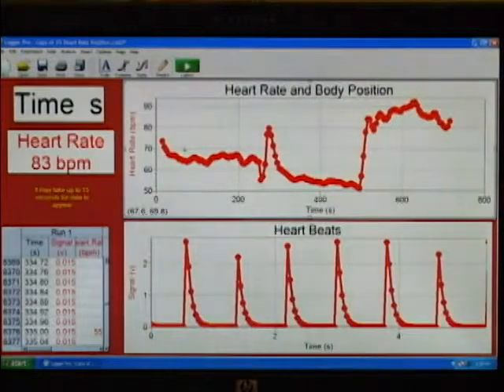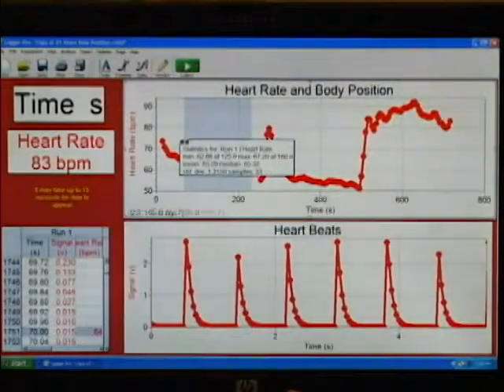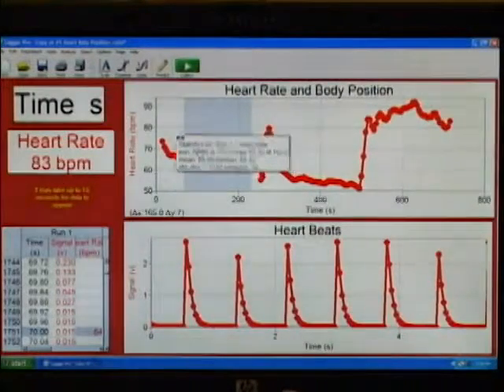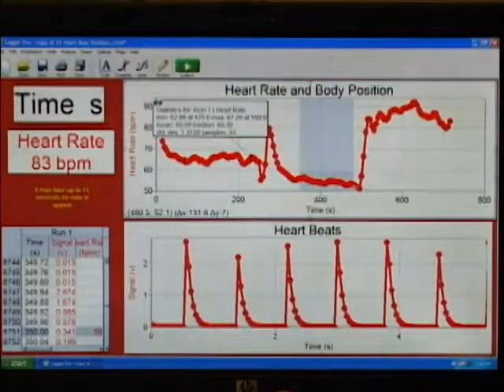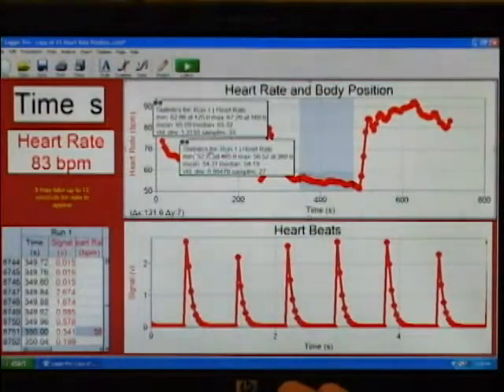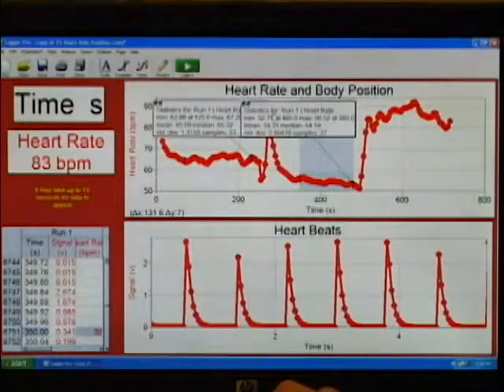Let's quickly take some average heart rate numbers to see what each of those was. If I select a region where he was sitting the entire time and do statistics, I find a mean of about 65 beats per minute for the sitting portion. I'll come down to the lying down portion, select a region, and do statistics there. The mean is 54 beats per minute for the lying down.